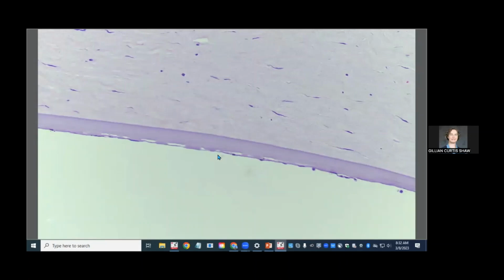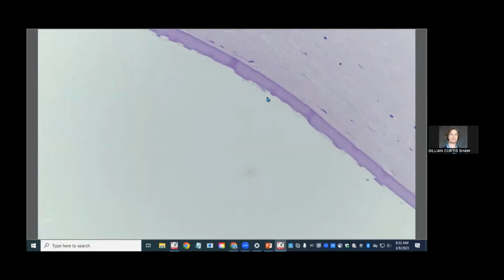And also, if you look around, Megan, I think you might see a two-tone coloring of Descemet's membrane. So doubling of Descemet's membrane is another possibility. And also areas where you don't see endothelial cells in here, which goes back to what Megan was saying. Imagine a flat mount where some of these cells, corneal endothelial cells, are post-mitotic theoretically.